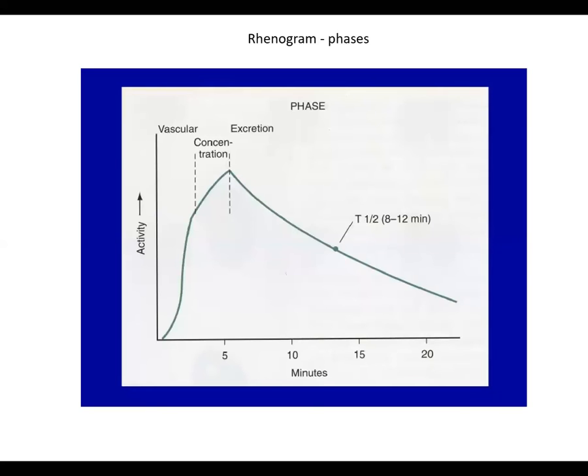Usually we place a radiometer probe over the right kidney, a second probe over the left kidney, a third probe sometimes over the urinary bladder, and usually a fourth probe over the heart to assess the radioactivity in blood and compare the clearance of blood from the radiopharmaceutical, which assesses the kidney's function.